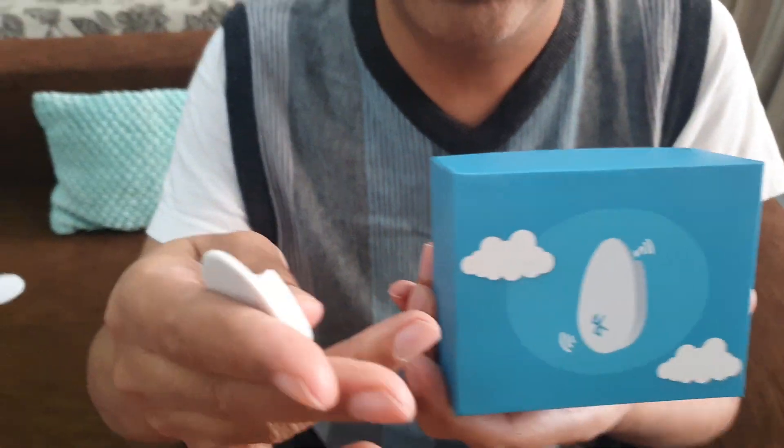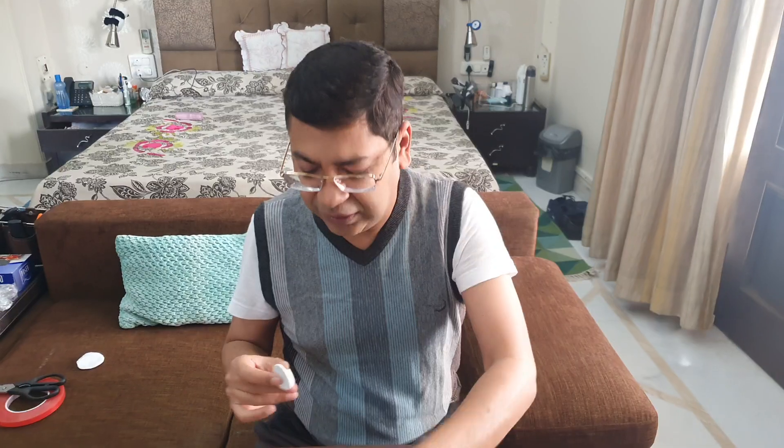So this is the box for this device. This is the Bubble, and the sensor actually gets stuck here like this on top of it.